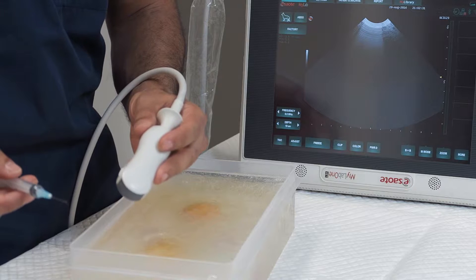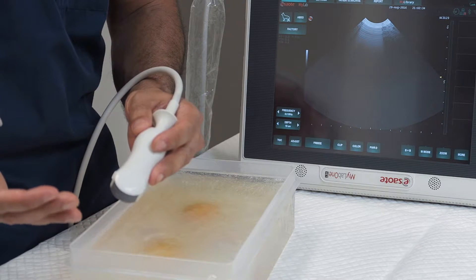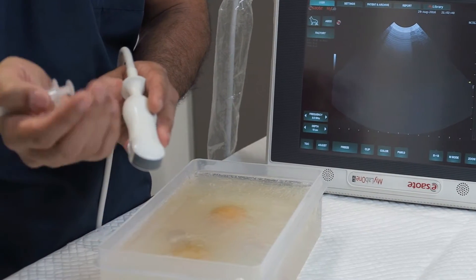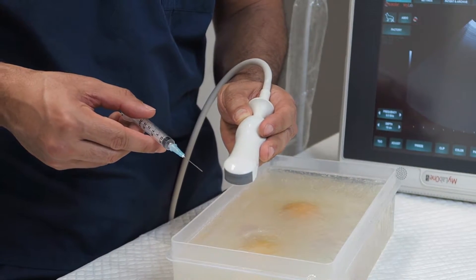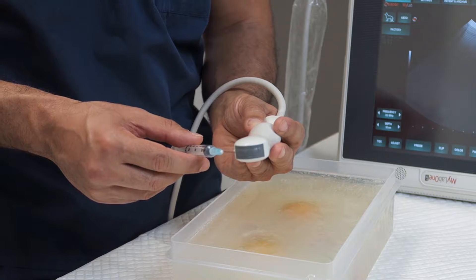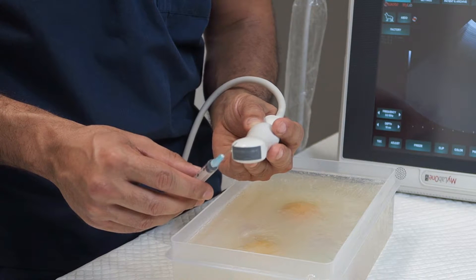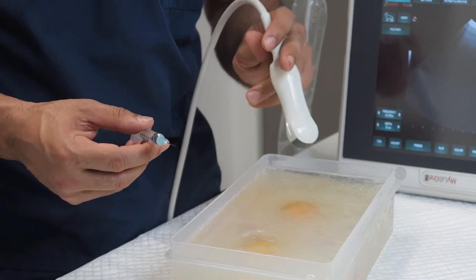The first thing to understand is the ultrasound beam. The ultrasound beam comes out flat, and when you insert your needle in, you want to make sure that the needle is in the same plane as the ultrasound beam. If you go on a weird angle, then you'll only see part of the needle and you will miss the tip. I'll demonstrate.